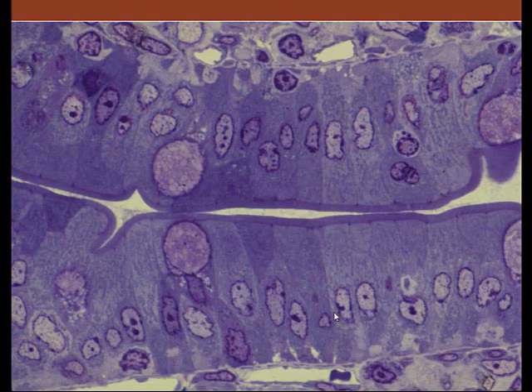In these intestinal absorptive cells, this is a single cell here. It's a simple columnar cell, simple one layer columnar. And note the brush border. These are projections off of the cell, microvilli of uniform length and high density as well.